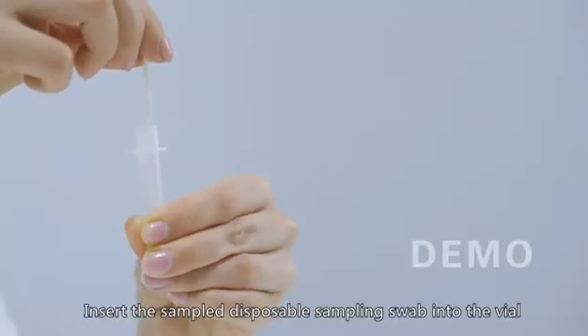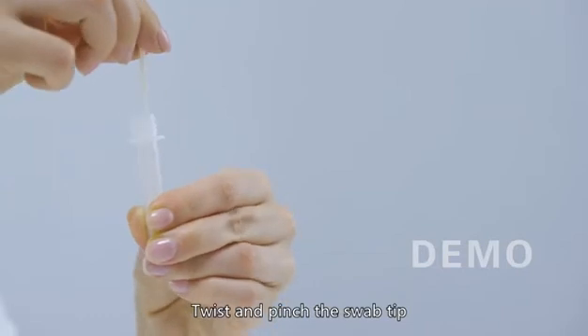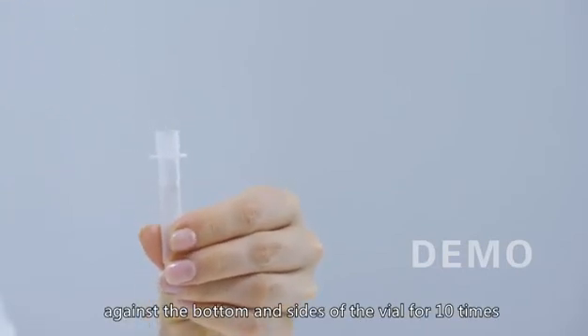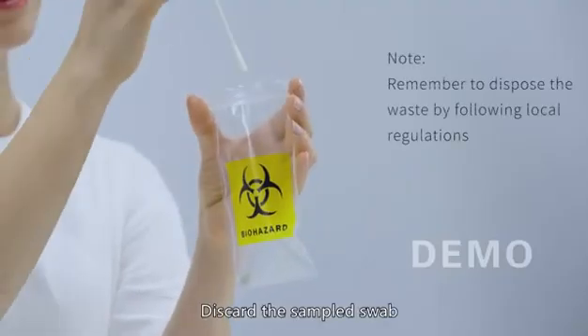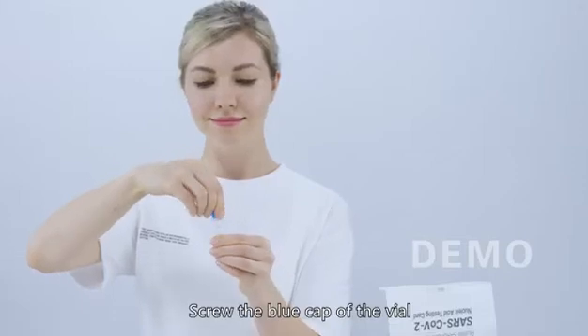Step 2 - Sample Processing: Insert the sampled disposable sampling swab into the vial. Twist and pinch the swab tip against the bottom and sides of the vial 10 times. Discard the sampled swab and vial seal into the waste bag, then screw on the blue cap of the vial.